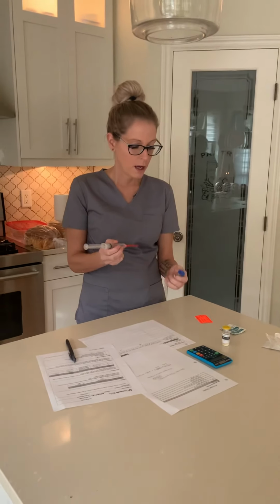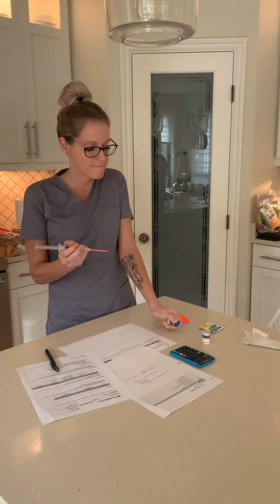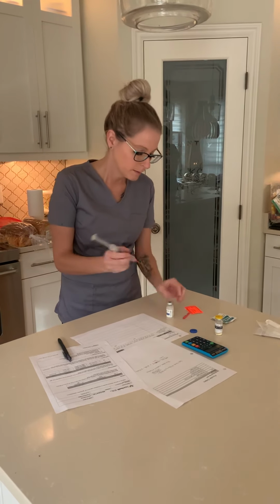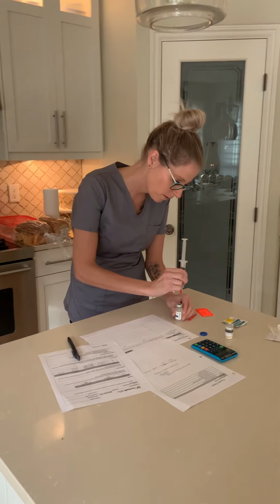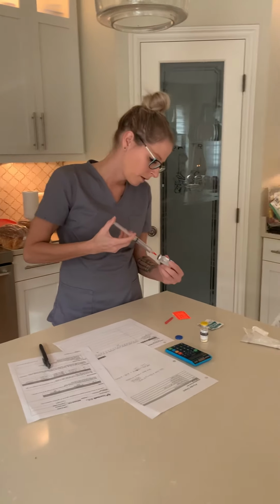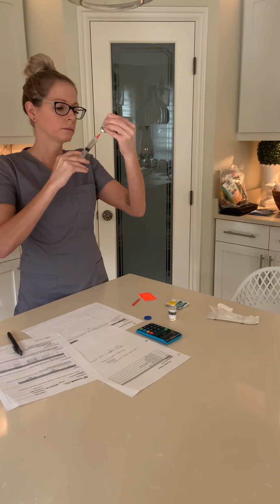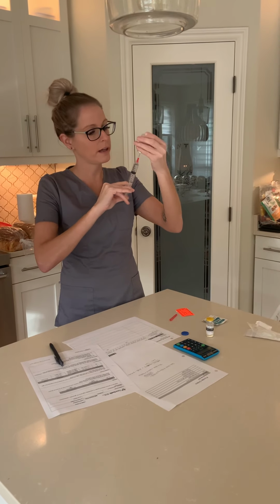Okay. I'm going to pop the top. It is sterile. If it was not, if the cap was off, I would have used an alcohol swab. So there's a lot of pressure in here right now, so I'm just gonna slowly draw it back, getting rid of the air and bubbles as necessary.